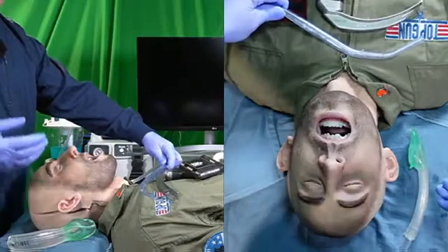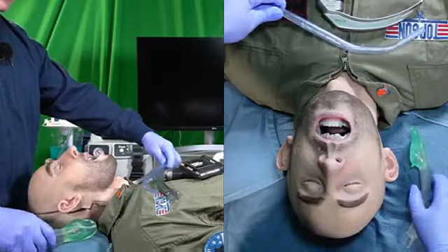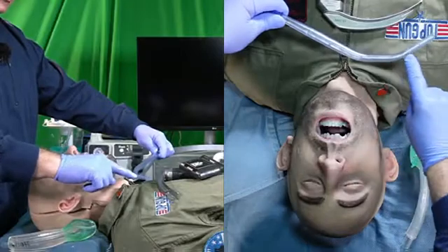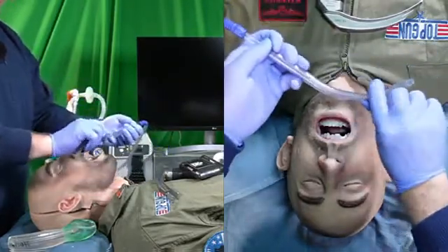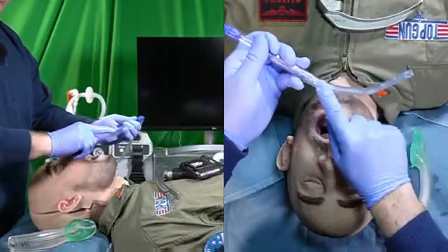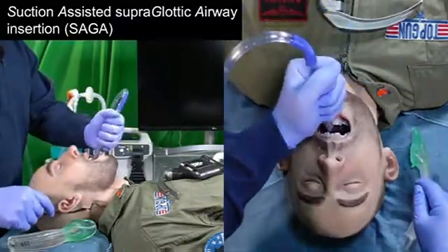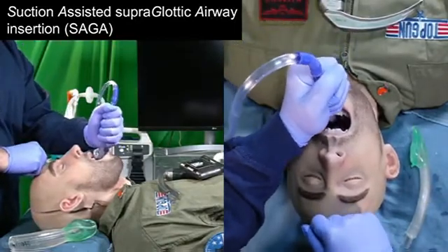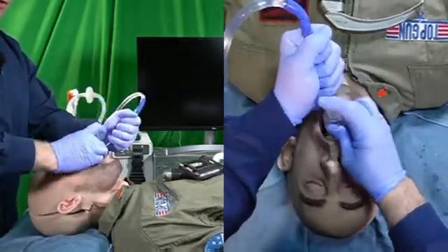What I'm going to recommend is, in lieu of utilizing an actual laryngoscope to place a supraglottic airway, we investigate the use of a preemptive suction maneuver that utilizes a rigid suction catheter. In this case, this is a large bore rigid suction catheter. A Yankauer will work, but this is a Ducanto. This is quite rigid, and it's anatomically shaped. This can be utilized in the same manner as a laryngoscope to pin the tongue into the floor of the mouth, distract the mandible inferiorly, to lift the base of tongue off the posterior pharyngeal wall, and to assist the insertion of the supraglottic airway.